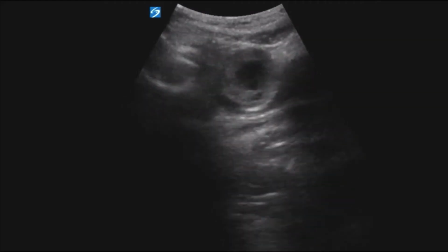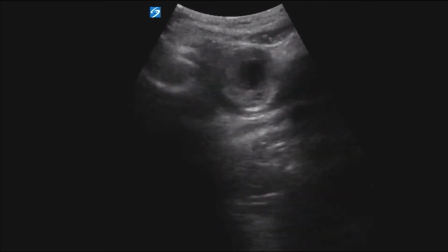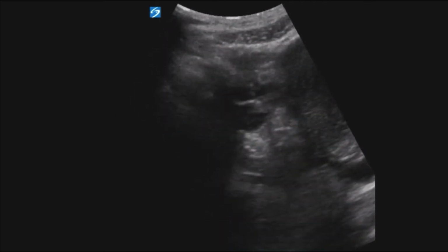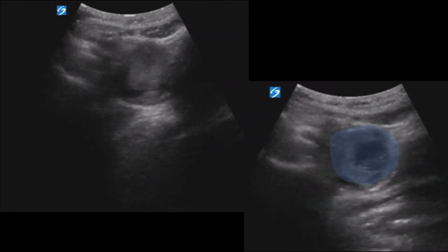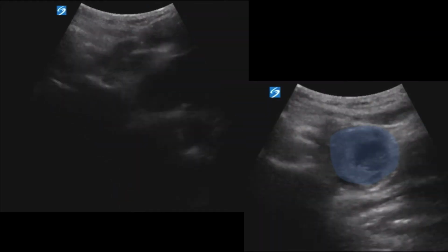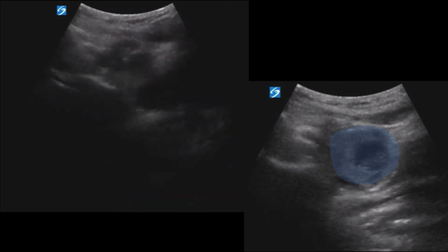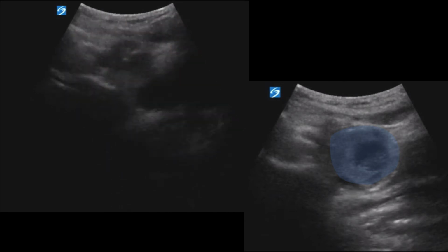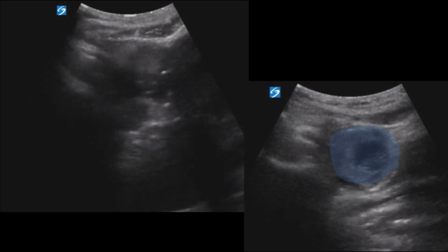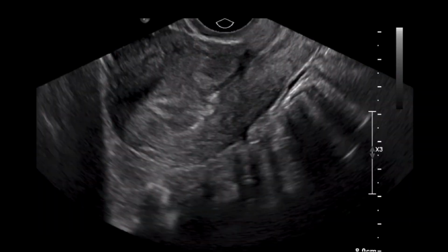The treatment team subsequently zoomed in and focused on this structure to assist in identification. Hopefully you can see that this structure is separate and outside the uterus, which can be seen just to its right. The abnormal adnexal structure is again highlighted in blue for easier identification. While I'd like to say these pictures are diagnostic, there is no way to give a definitive diagnosis based on these images. However, when the labs resulted with a beta HCG of 35,000, the team's already present concern for an ectopic increased substantially. A radiology performed transvaginal ultrasound was subsequently completed.